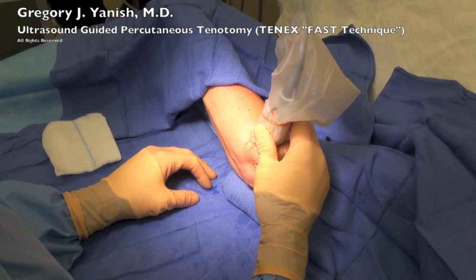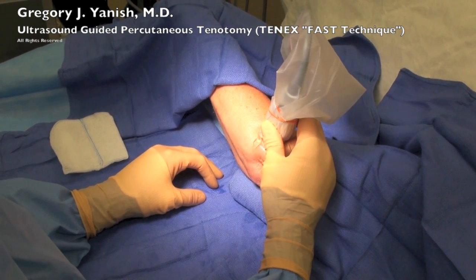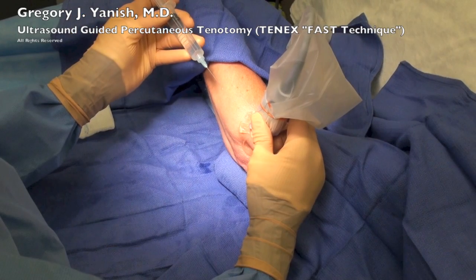I carefully scan this entire area, really getting a good feel for the tear. Here's another picture — this is the tear seen above the bone in the common extensor origin.